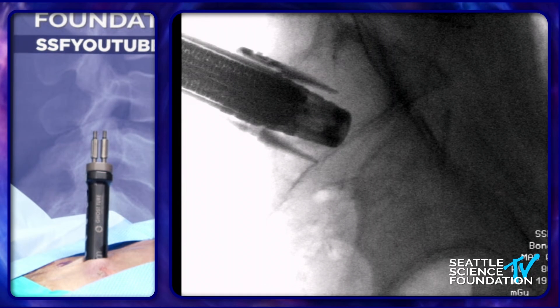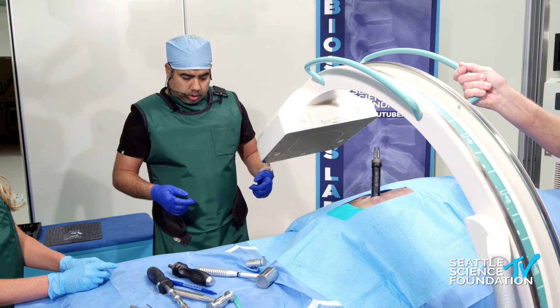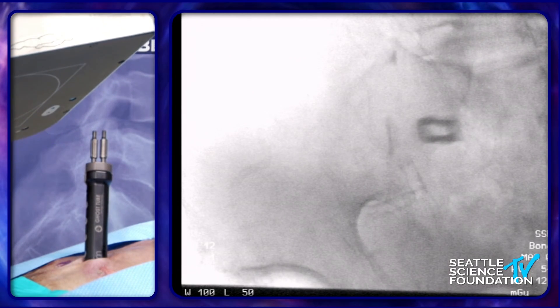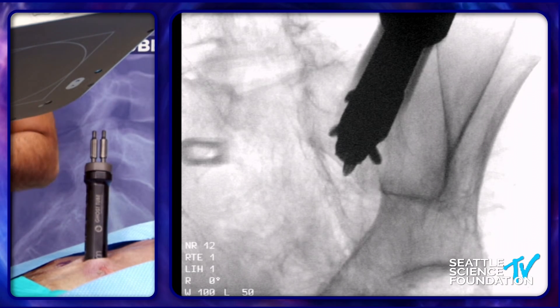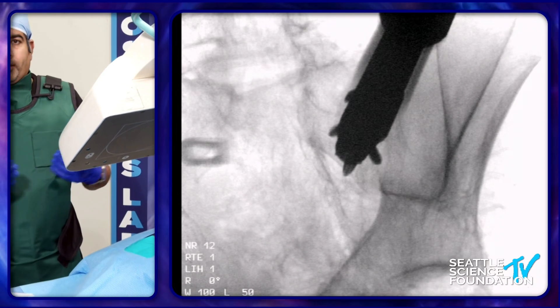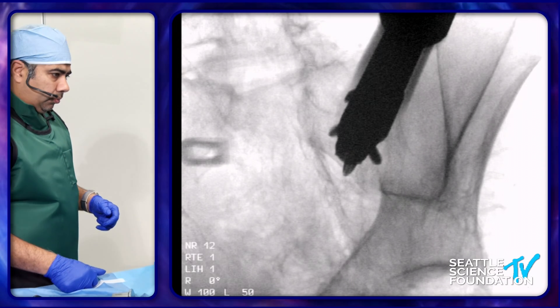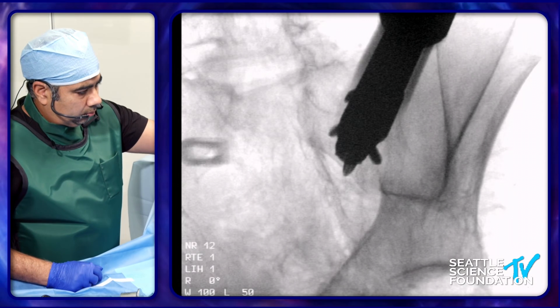At this point we can do a check X-ray — let's go back to that oblique. On the oblique X-ray you see the two screws popping out: one is on the sacrum, the other on the ileum. Now I know that my transfixation is basically done. The next step is to take the whole instrument out and leave the implant there. Let's go back to lateral.